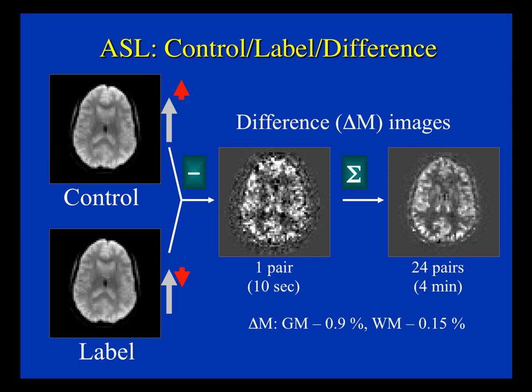We don't have to wait for a full recovery of 5 T1s, but you will be using a TR of about 3 to 4 seconds or so, generally.